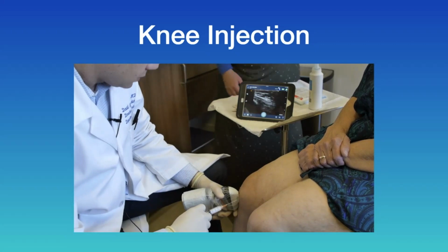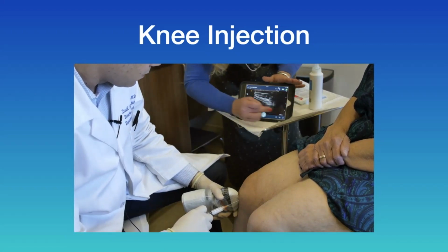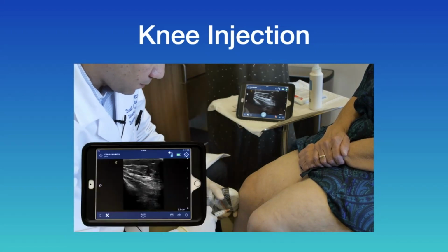Okay, press save the camera. No, I meant the movie film. Pinch.